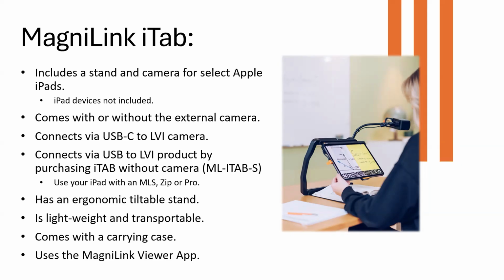You can't tell it's there. It's really sleek how they put it in, but it allows you to plug the camera in at the top, and you can also charge the iPad while you're using it. That's unique, and there are some definite benefits to having this stand.